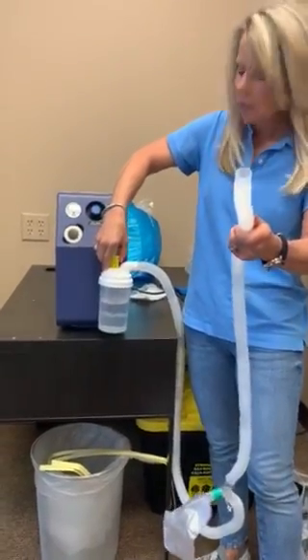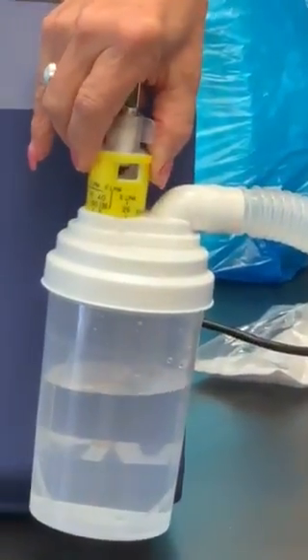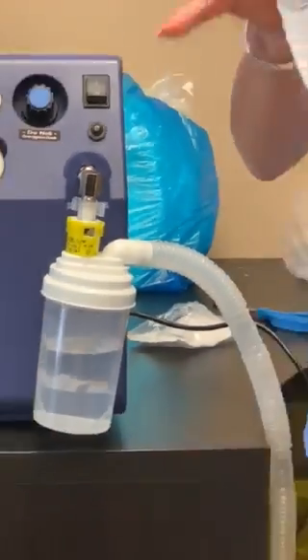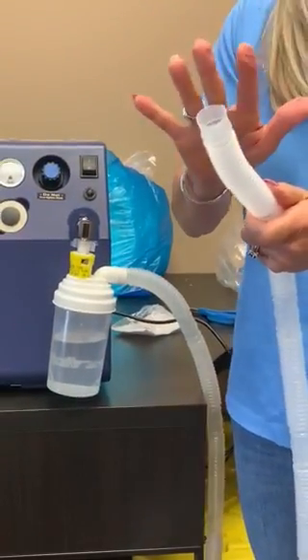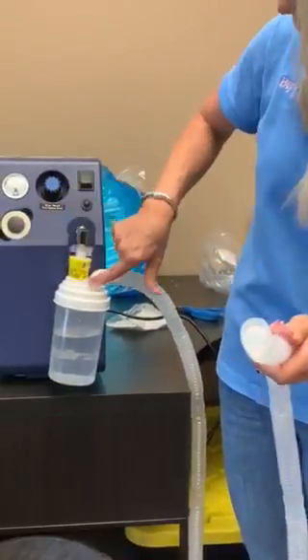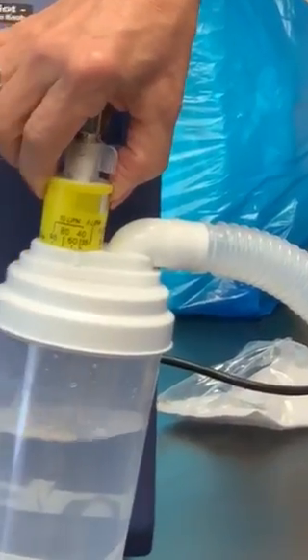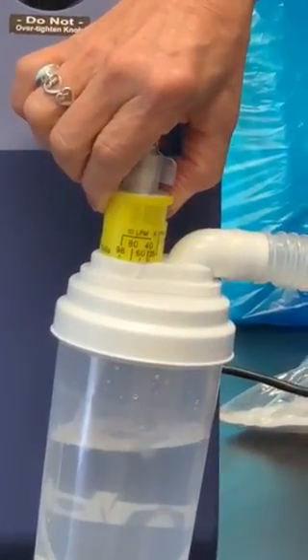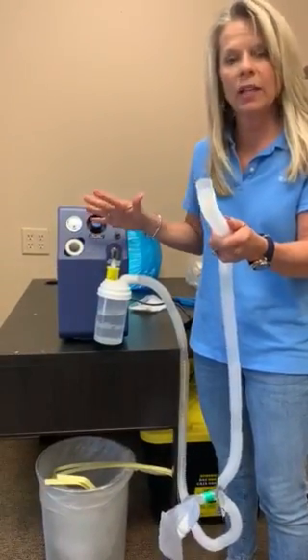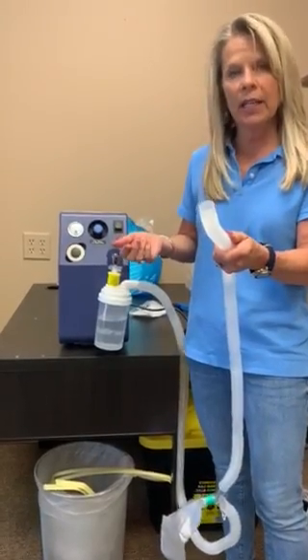The other way we can adjust the flow is if we open up the entrainment — you see it gets loud, the mist gets fine, and it's giving more than they need. So we usually set this at 60 by the arrow down here. I'm going to turn this to 60 and that's going to give them enough. Those are the two ways you can adjust it to make it comfortable for the patient and give them the moisture they need.